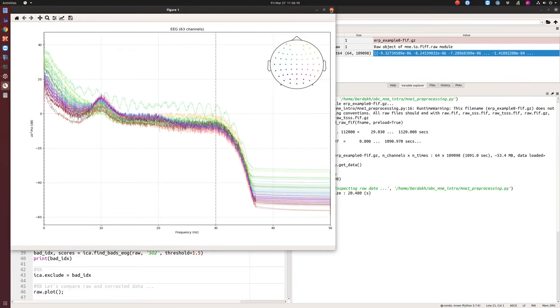The method identifies bad components — for example, components 12, 9, 16, and 7 are flagged as artifacts. The threshold is subjective; the default is 3, but here I'm being more conservative. We exclude those components, and after applying ICA to clean the data, those artifact patterns are gone.